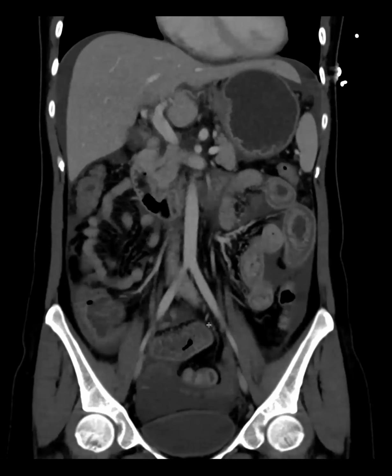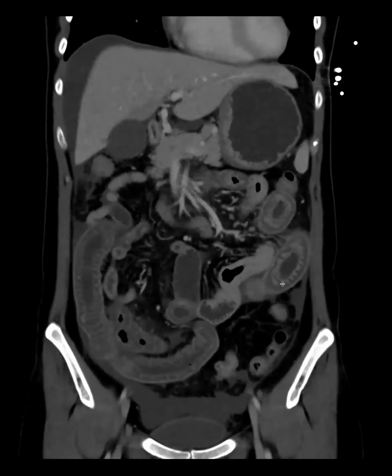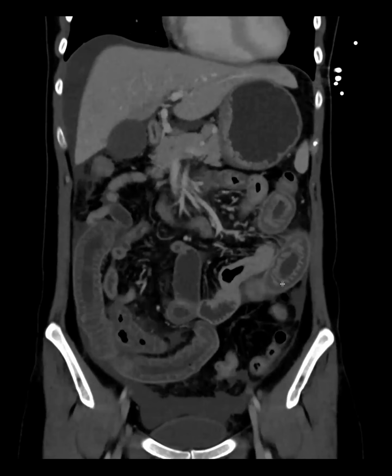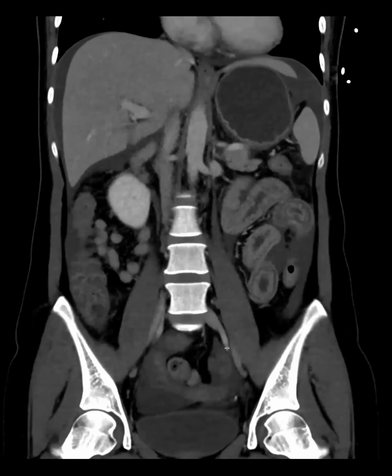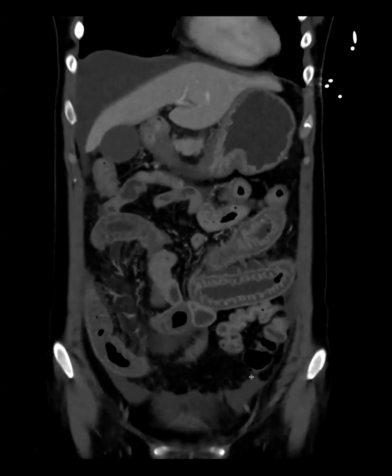So I'm thinking about enteritis, hypovolemia, some kind of vasculitis, ischemia, but that's like a weird distribution. Yes, indeed. Something else that we always think of when people have long segment small bowel wall thickening is ACE inhibitor therapy, if she's on ACE inhibitors. And it looks too extensive without strictures to be inflammatory bowel disease. Excellent. So all these differentials are very good and valid when patients present with diarrhea and an infectious inflammatory kind of clinical picture.